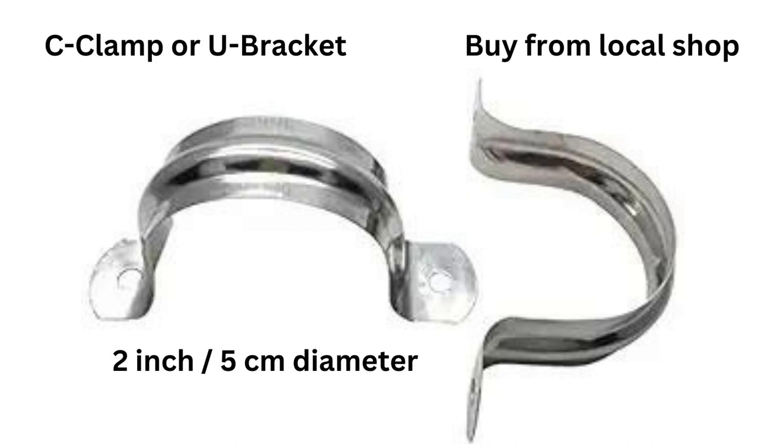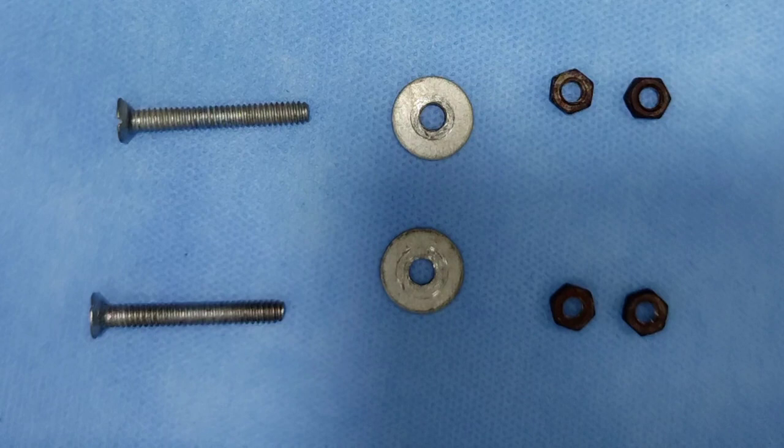Once you have got this wall mount, the next armamentarium is this type of a C clamp. This clamp is described as a 2 inch clamp — the diameter of the half circle is 2 inch. This can vary, but most dental chairs will have a pipe of 2 inch or 2.5 inch. This 2 inch clamp can work for both. Next are this type of screws — they have to be compulsorily long, around 2 inch length, and each screw should have two nuts for extra protection. You can additionally add some washers. So these are the three armamentariums required to connect a screen to a dental chair.